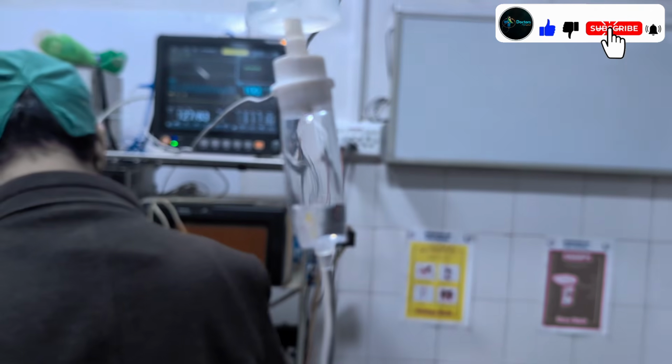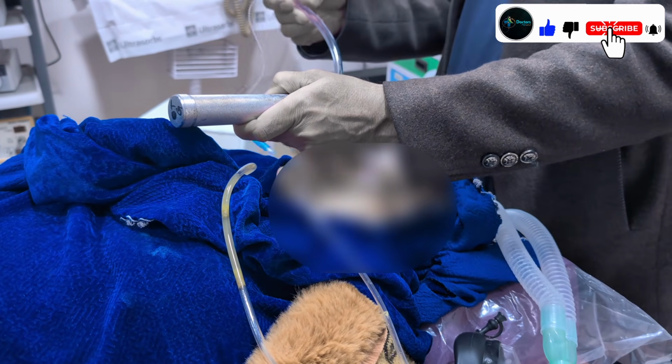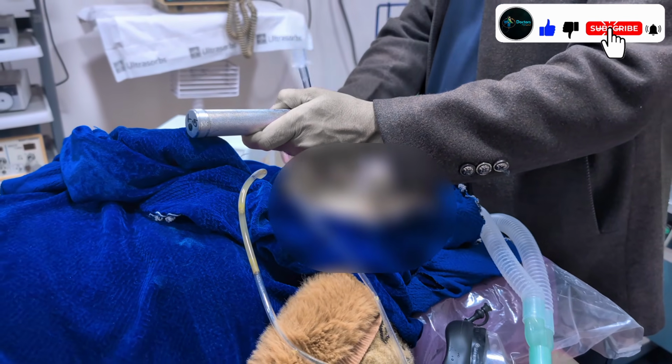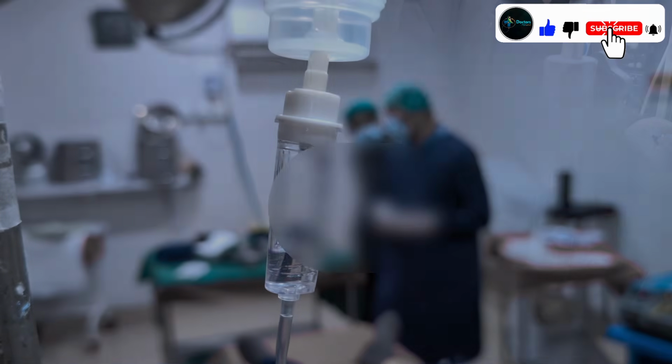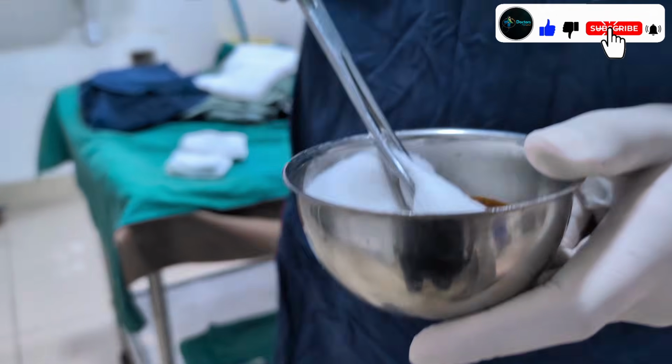After completing the ventilation process for 3 minutes, we will move to the intubation step. As you can see, now we will intubate the patient. We will pass the endotracheal tube ET2 so that the patient can get oxygen properly. This is the infusion that we have started.